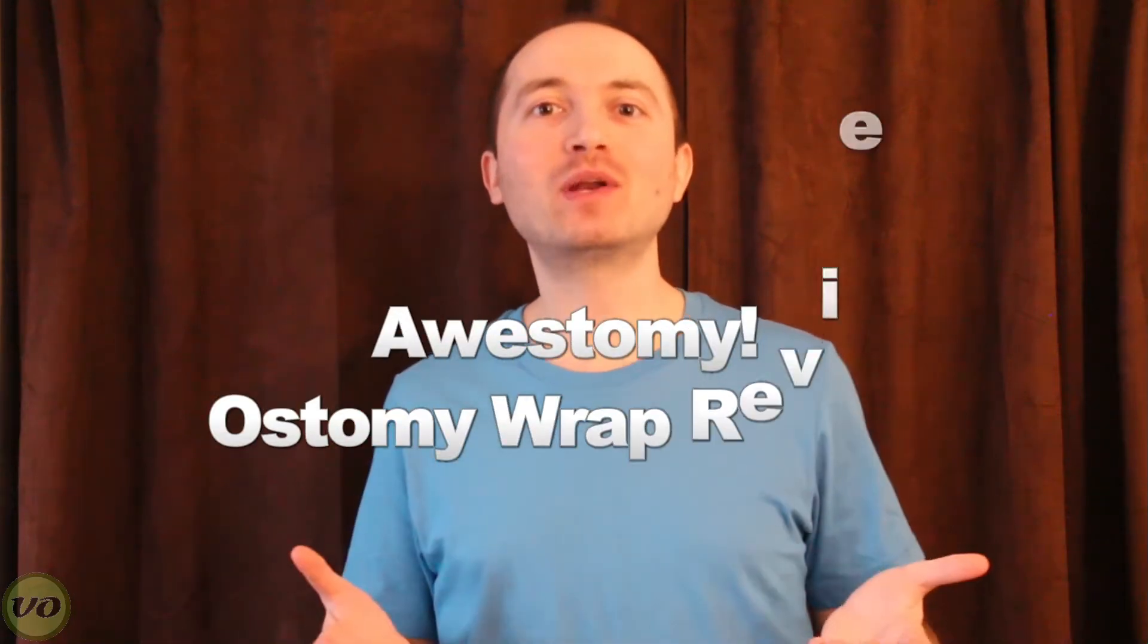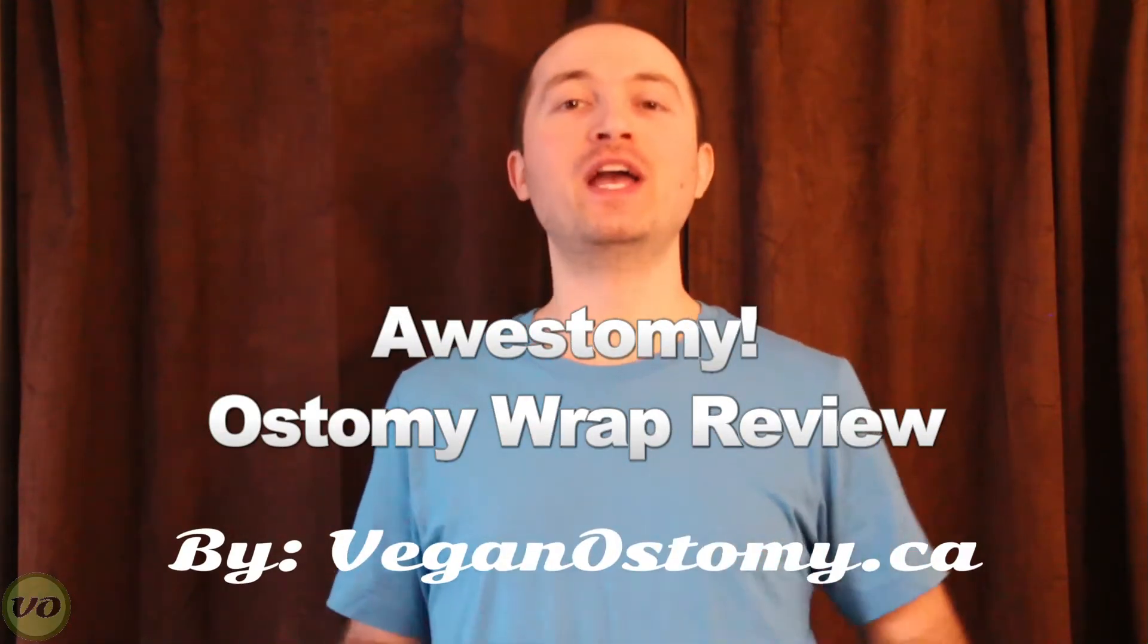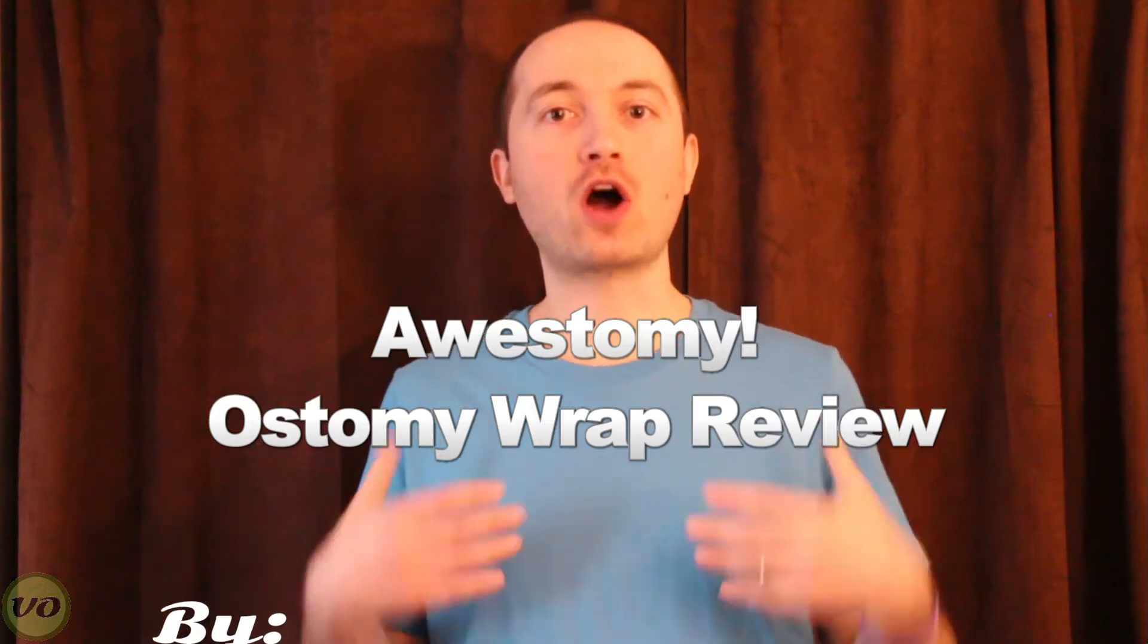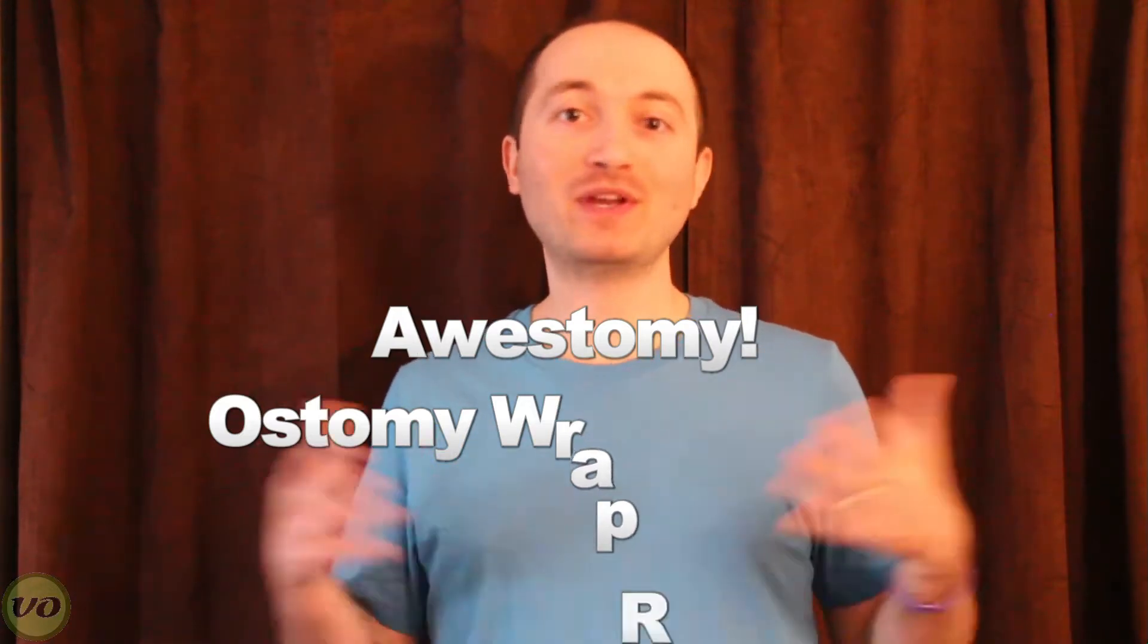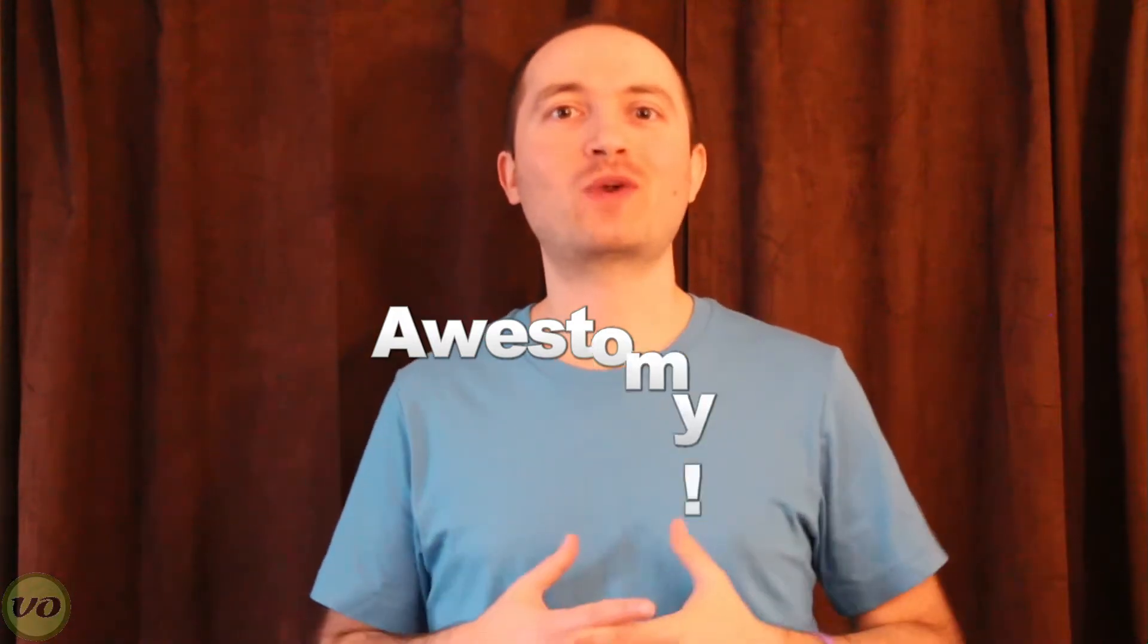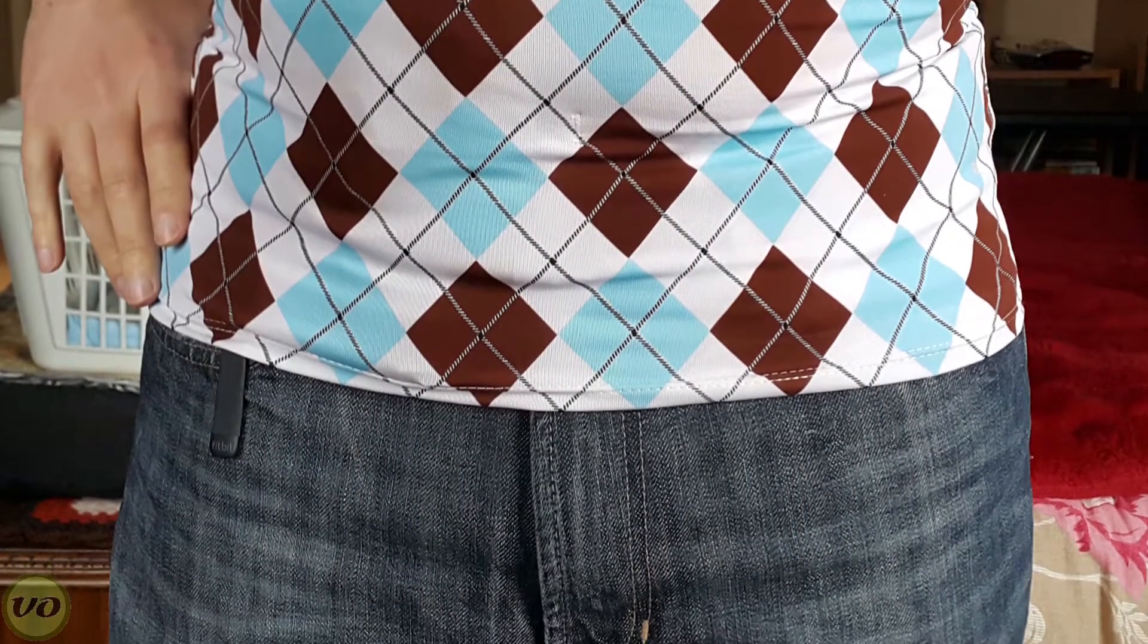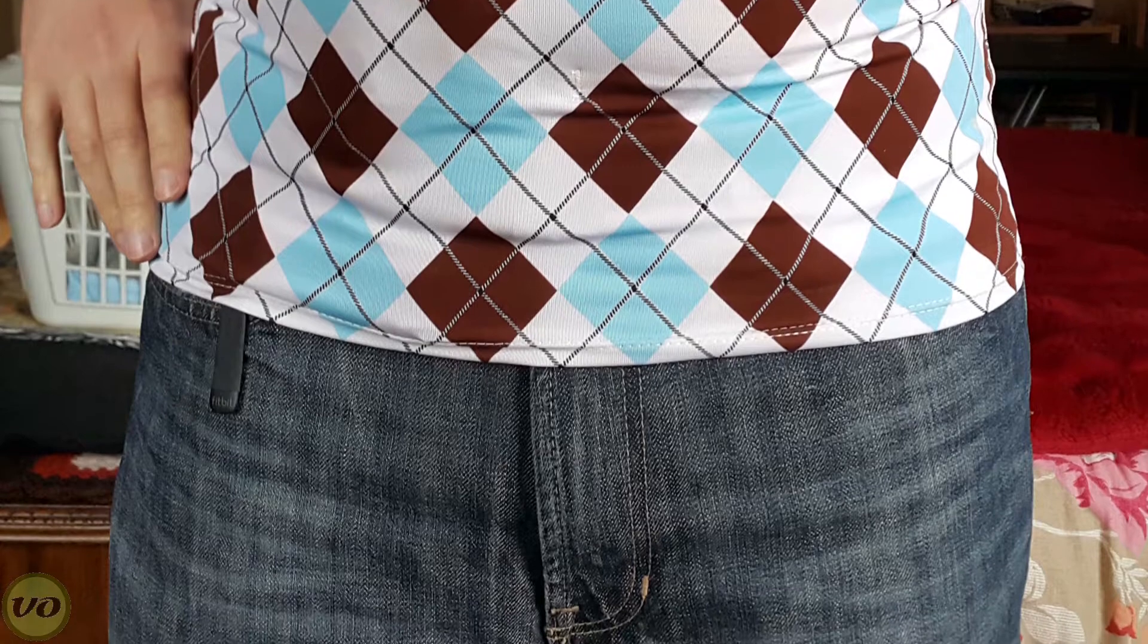Hey guys, it's Eric. Today I want to bring to you another product review. Now this one is for another ostomy wrap. Now I'm a big fan of ostomy wraps. I think they're a great accessory to have. There are so many features and benefits that they offer and I'm going to talk to you a little bit about the ones in this video.